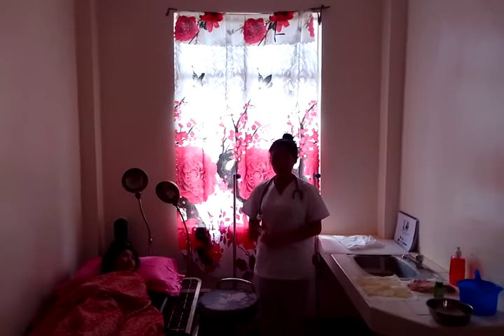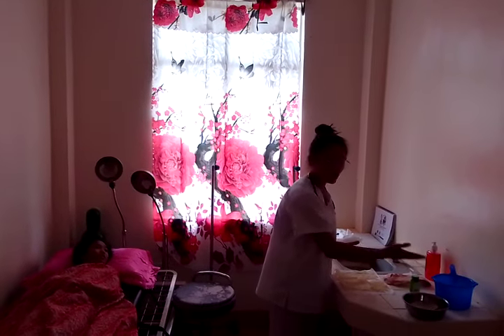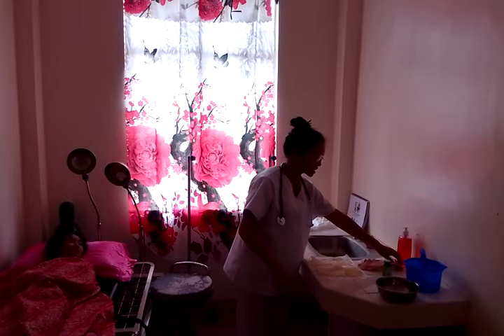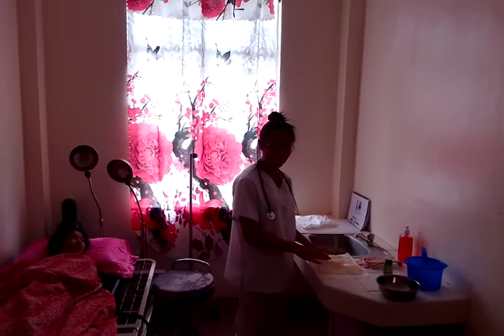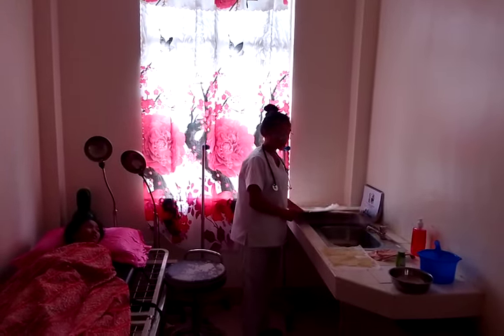After that, we need to gather all needed equipment. The equipment for today includes: a waste receptacle, basin, soap, washcloth, gloves, alcohol, linen, and the doctor's order.